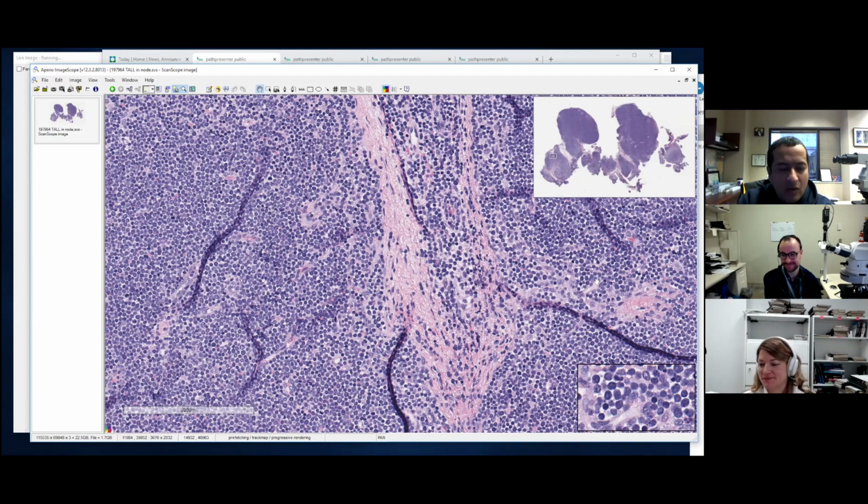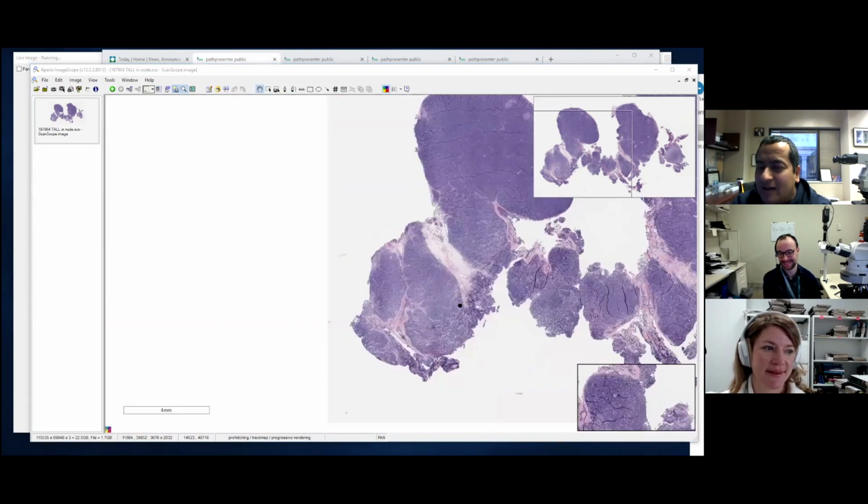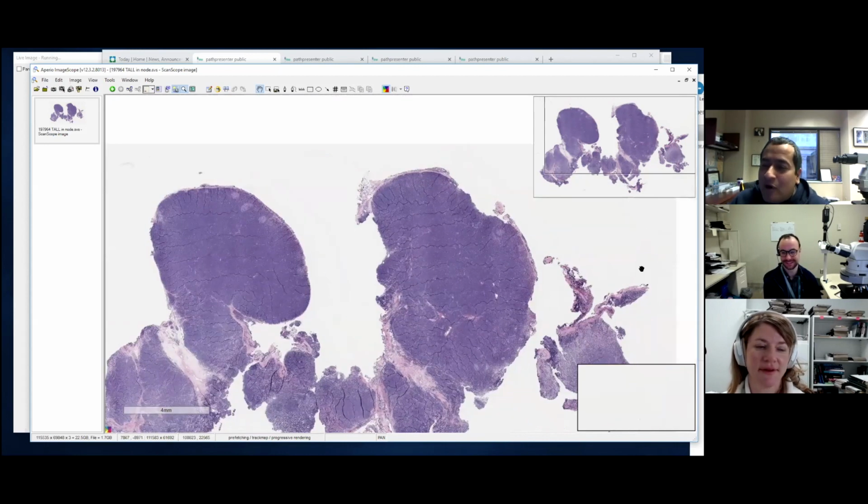That's true. So, okay. It sounds like you're not too worried about those, but obviously this looks like a tumor. If you get something like this, it's pretty easy. Part of the reason I'm not worried about it is because I shunt it off to you guys. You have to worry about it. At least from my point of view, the main question is when to worry about it. We get so many thymomas and almost no lymphoblastic lymphomas that we have to decide when is the time that you should worry about missing a lymphoblastic. That's how I come at it.